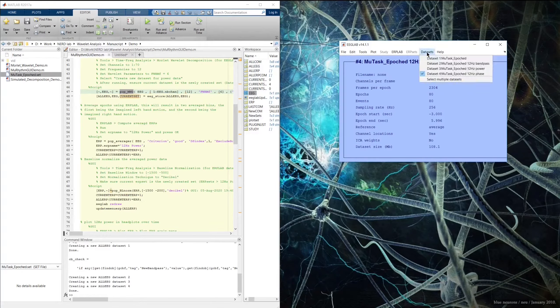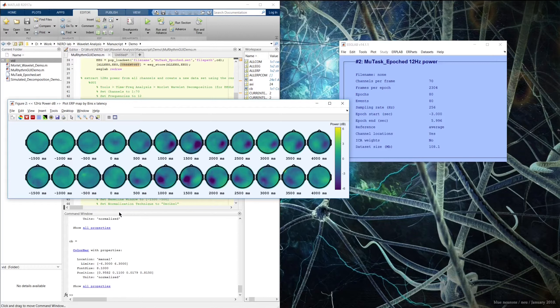Also included in the mu rhythm GUI demo is a script performing the equivalent analysis that we did in the GUI. Running this script produces our mu rhythm ERD again, but in script you have a lot more control over plot appearance so it looks much better. Instead of jet, I'm using the colormap VIRIDIS, which is a perceptually uniform colormap not included with MATLAB by default, but that I've included with this time frequency analysis package. This demonstrates how to use the TFA package in conjunction with both EEGLAB and ERPLAB to compute a mu rhythm ERD across all channels and over time.